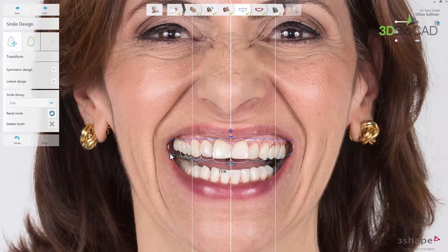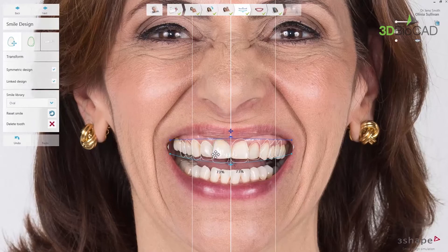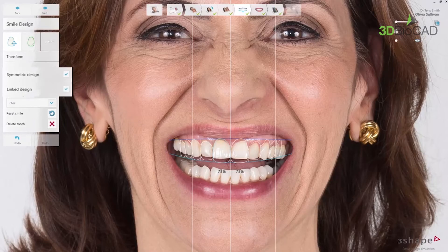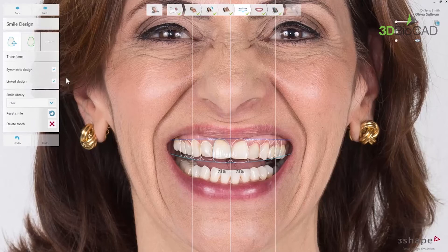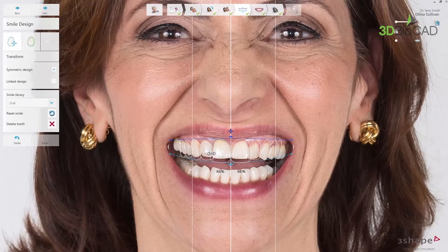By default, the smile design step opens with the transform tool active. The tooth, when chosen and activated, can be moved around to adjust the position — just click on it and drag. You can also use the symmetric design and linked design mode to design shapes in relation to other teeth. In the default setting, both are activated. Symmetric design allows you to work on the chosen tooth and the contralateral tooth at the same time. Linked design allows you to adjust the tooth and its neighbour at the same time.